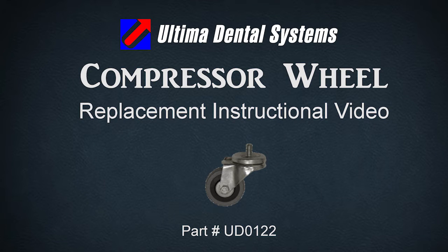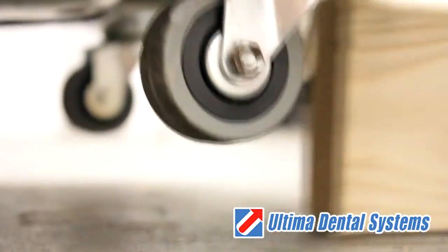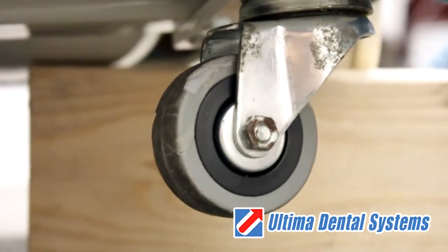Welcome to Ultima Dental Systems instructional video on changing the wheel. Begin by raising the unit and compressor up off the floor. Here we are using a piece of 2x4.